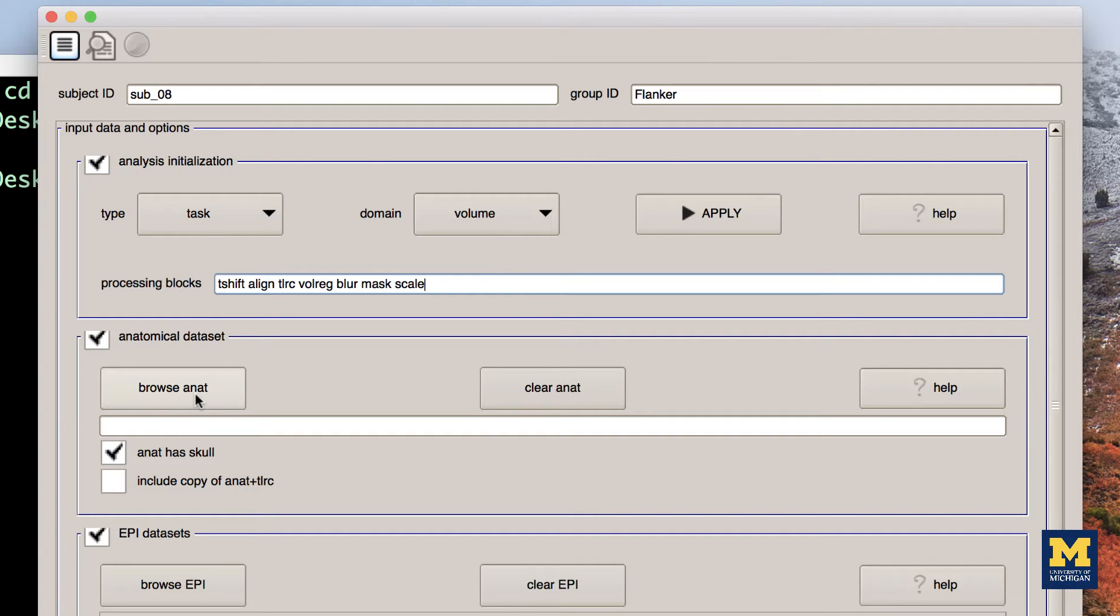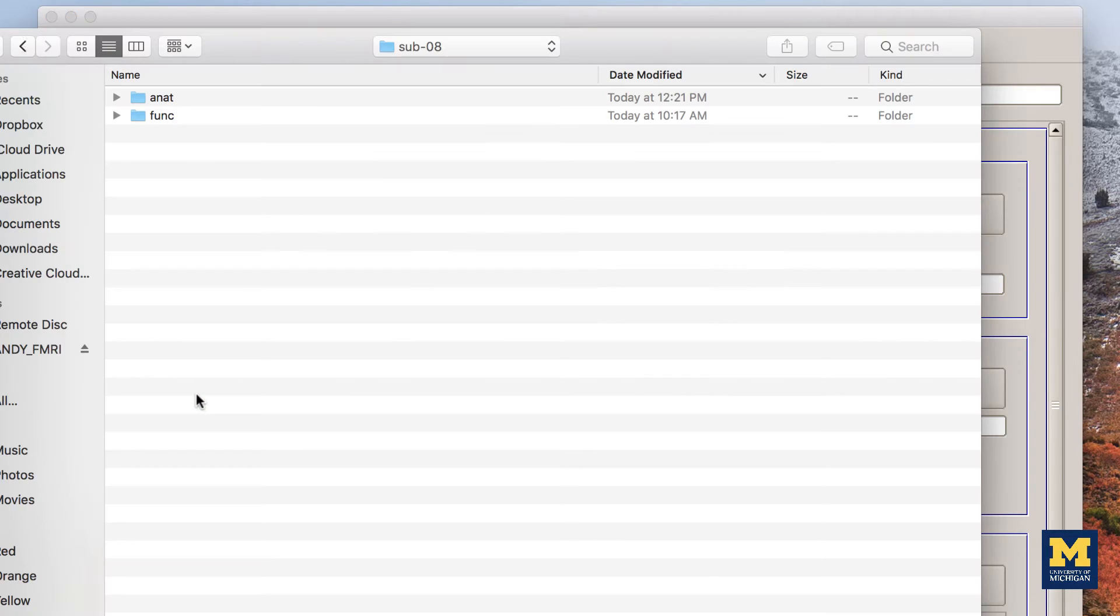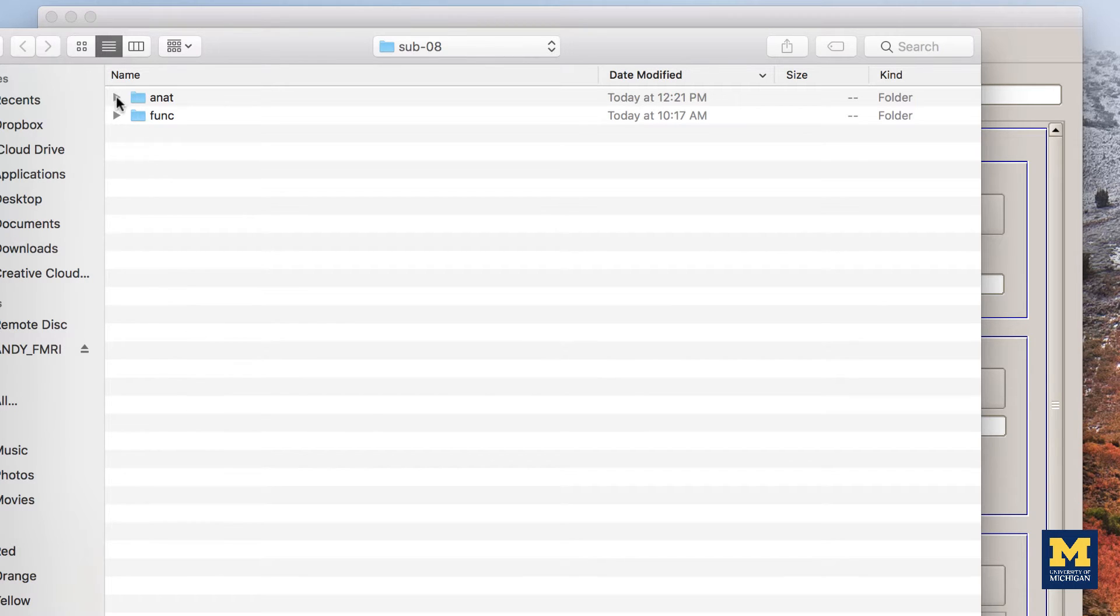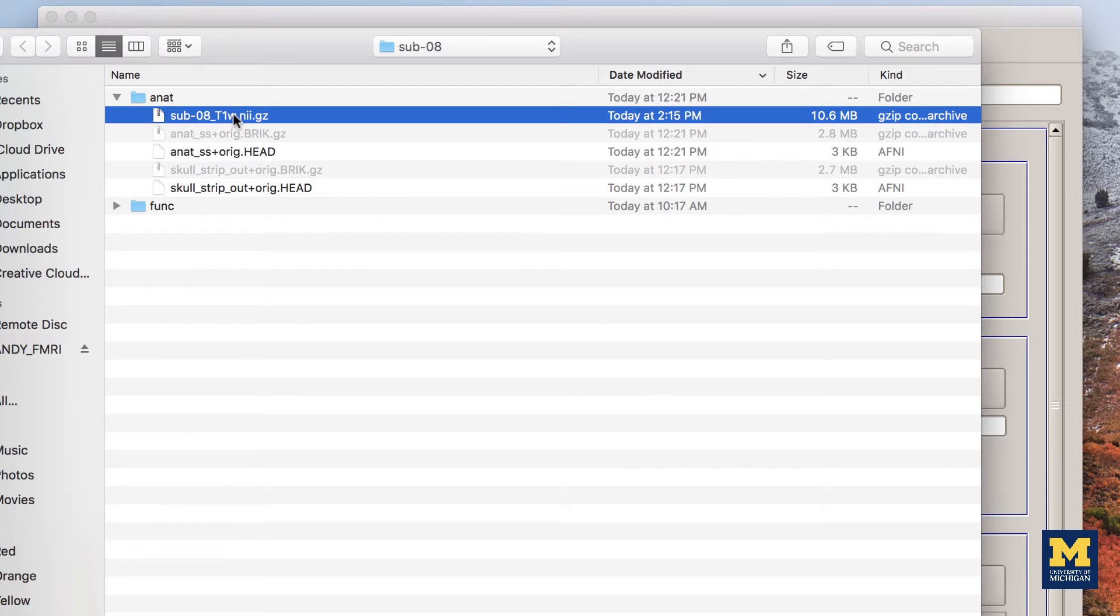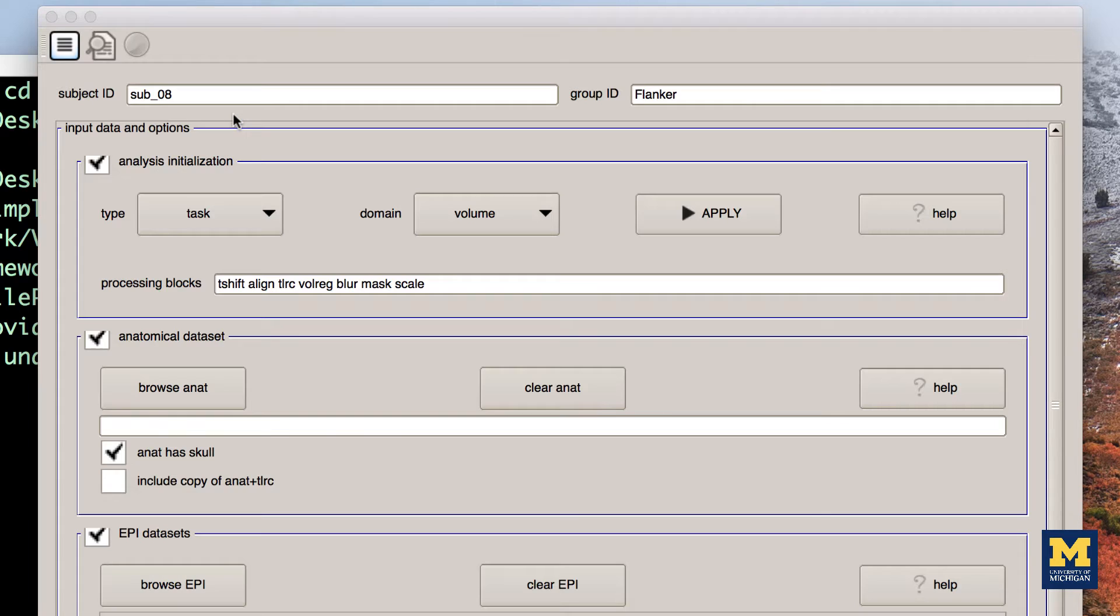Then, click on the Browse ANAT button in the Anatomical Datasets section. Navigate to the ANAT directory and select the file sub-08-T1W-NII.GZ.